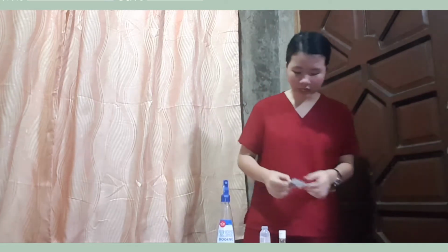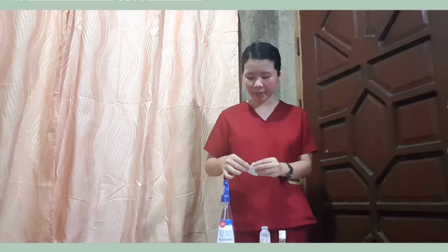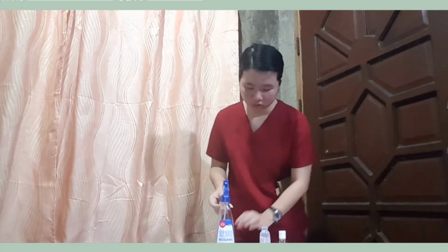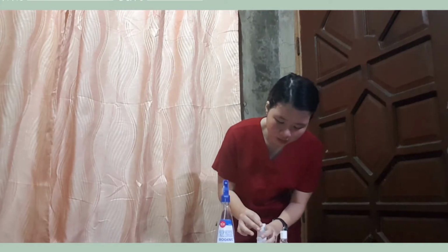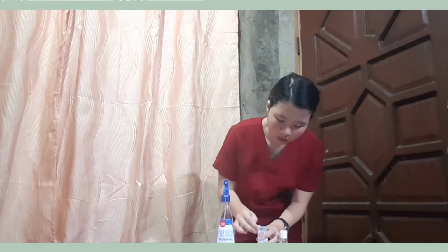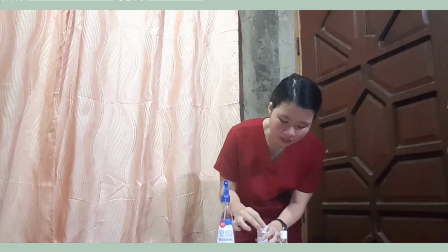Okay, so now we're going to proceed to procedure number 8, which is to disinfect the rubber stopper of the 2 insulin and let it dry. This is to remove surface bacteria and prevent contamination. So we have here an alcohol prep pad. We are going to use a different alcohol prep pad to each bottle of insulin. You need to clean these for 30 seconds each.